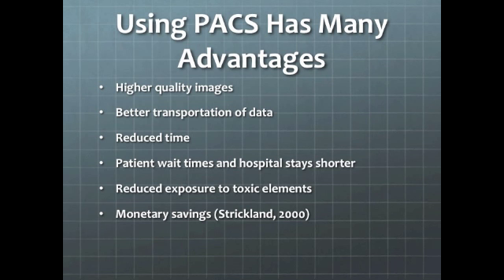There are also economic savings from switching from film-based to digital, which can be felt in many areas: on purchasing films, the chemical to process the films, the film jackets and packets, and salary of the staff that would be needed to process the film. Also on the film-based equipment, the film storage space, handling costs, and transcription costs.